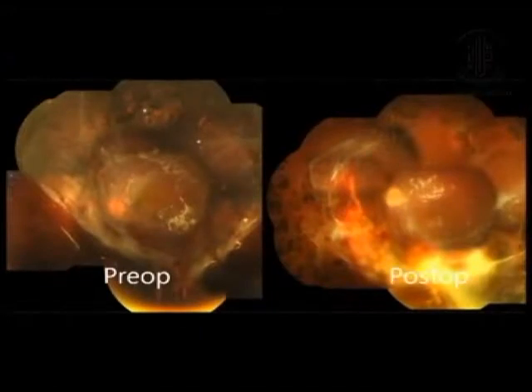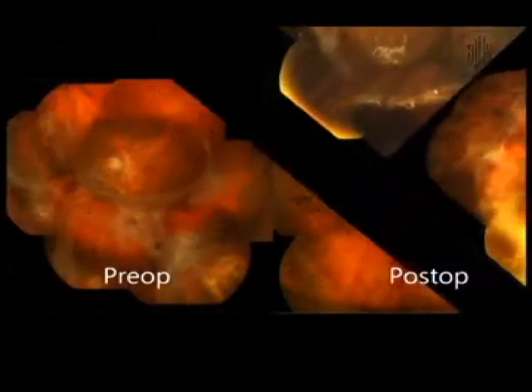Thus, even in these slippery terrains of subsilicone oil retinal detachments, one could achieve satisfactory results.